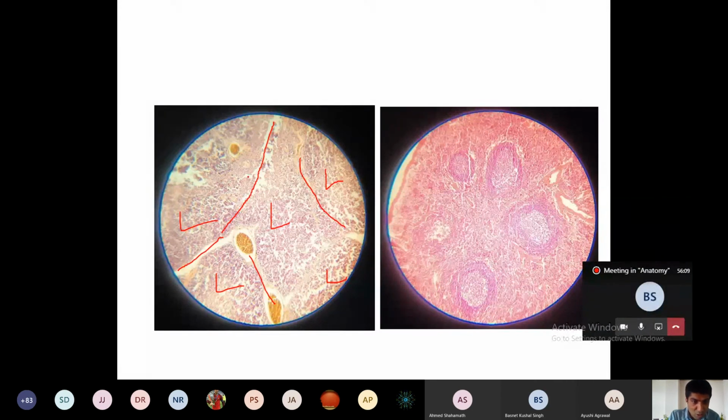And each lobule consists of the outer part. This outer part is known as cortex, and the inner part is known as medulla. This you can write. And it is mentioned within the medulla. If you see it very properly in a good section, there will be the presence of the Hassall's corpuscle. This you can write even though you are not seeing the section, but here it is.